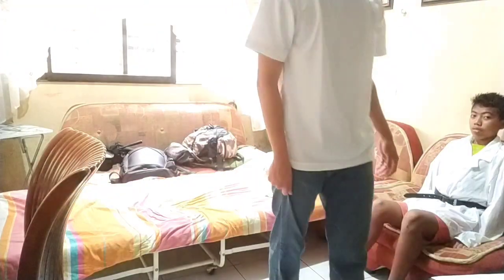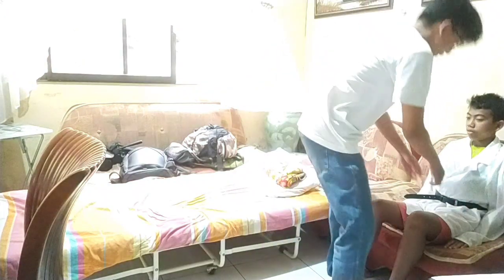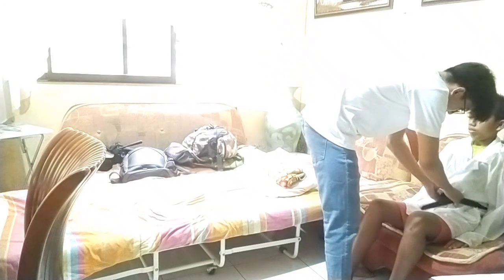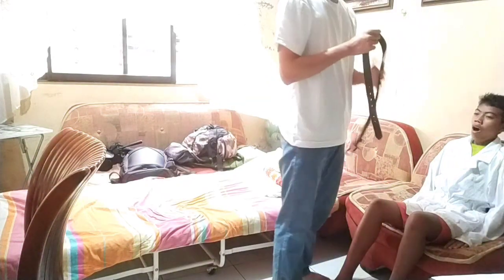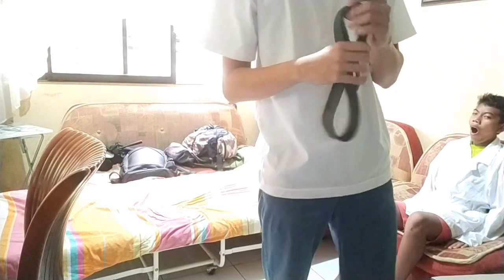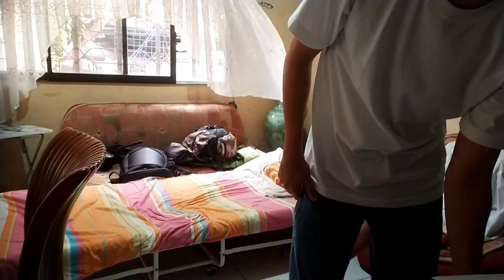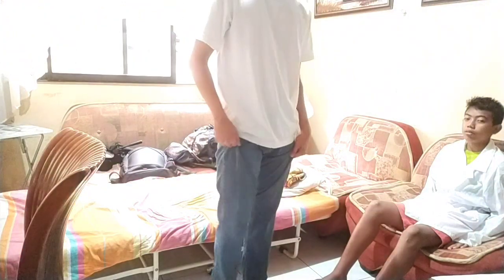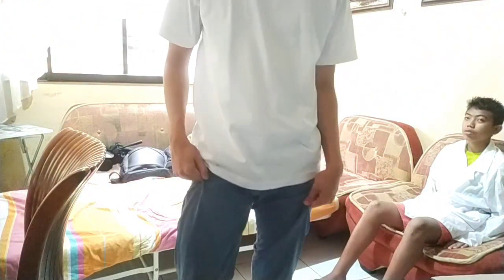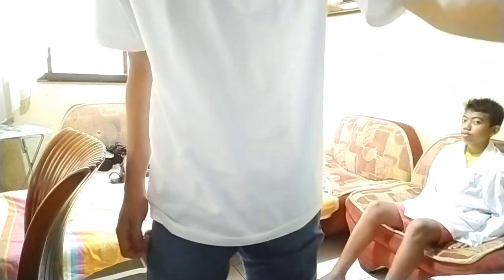So, after that, remove the gait or transfer belt. And place them near if any emergency occurs. Lower the foot plates and place the client's feet on them if applicable. So that's it. And let's proceed to the variation transferring with a belt and two nurses.